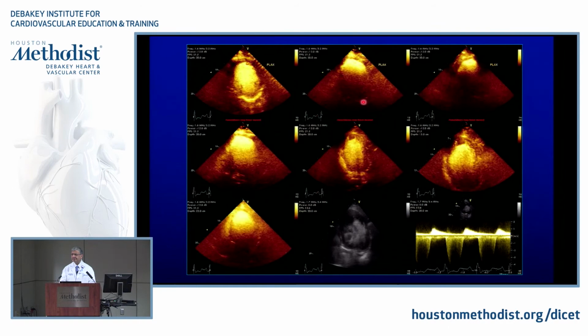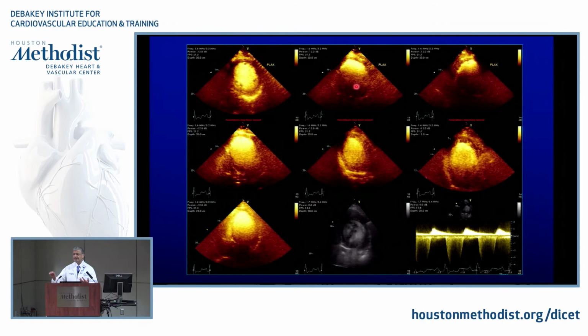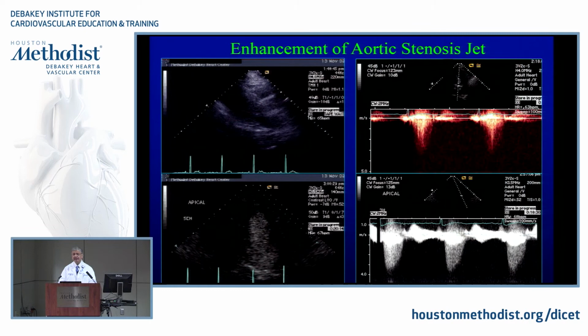Right? So at times you do tricks. I prefer not to do the tricks. If I inject too much contrast here, I crank up my mechanical index so I can destroy quite a bit of contrast and then bring it back, right? But, well, we don't need that, do we? Prefer not to. And you can enhance aortic stenosis jets.